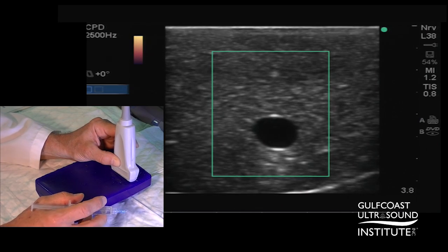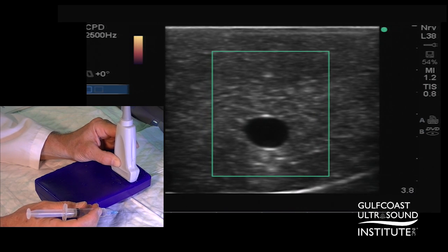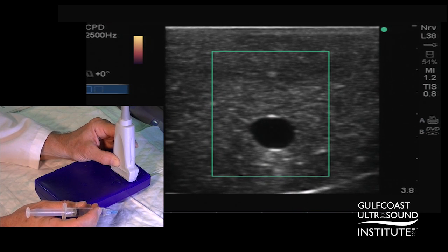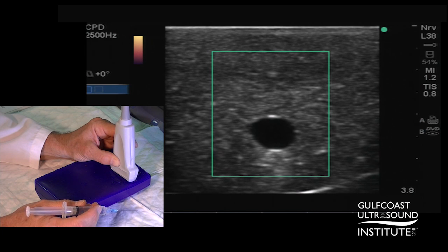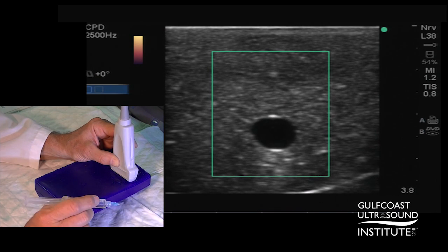In this case, if your machine has Power Color Doppler, you can use this to help assist with following the movement of the needle tip. I've activated the Power Color Doppler and I have it in a medium PRF and a low wall filter setting.